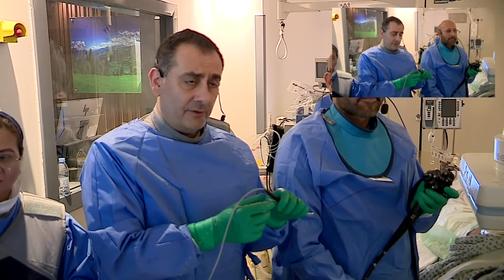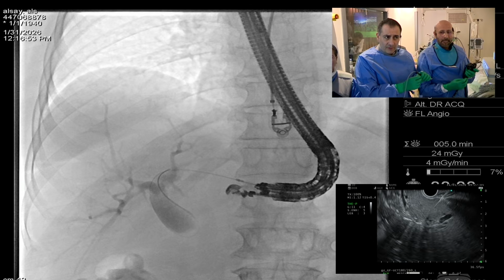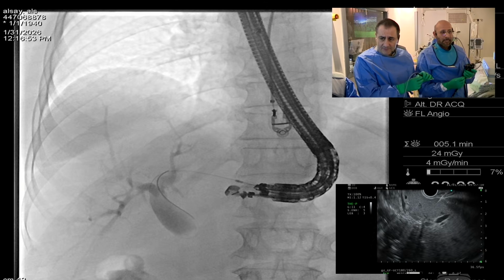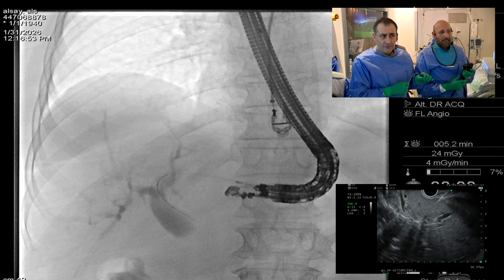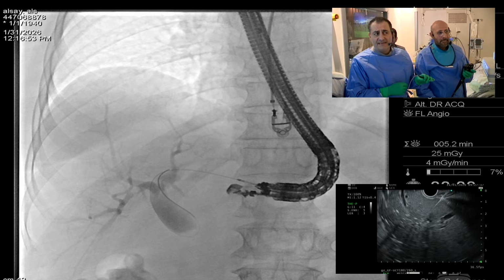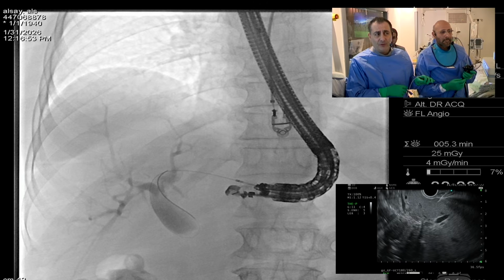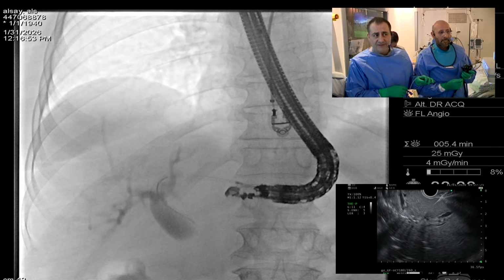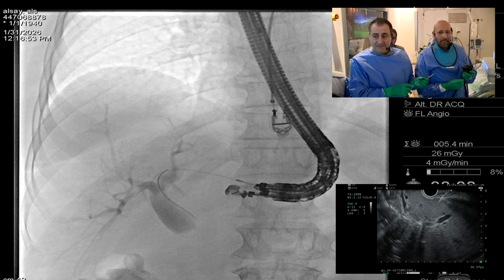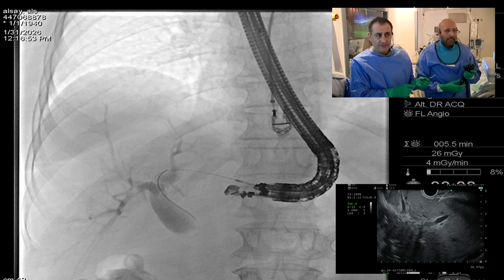Let's go. Possible to ask a quick question? Yeah, go ahead. This is palliative. It's metastatic pancreatic cancer. And what is your preference here, antegrade versus? Well, we're going to do hepaticogastrostomy because he has a gastric outlet obstruction. Basically you can't get to D2 anymore, so we're going to do a hepaticogastrostomy in this case. Sorry, I meant antegrade from AGR. Antegrade, but with a transhepatic stent. So basically, it's going to be hepaticogastrostomy.